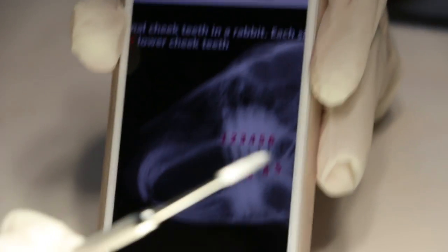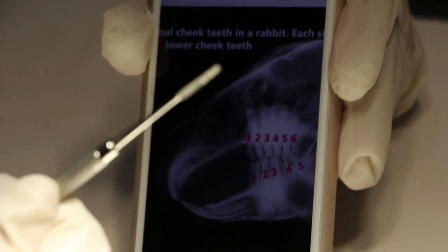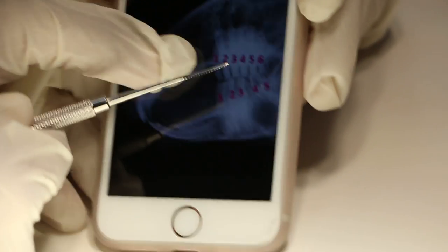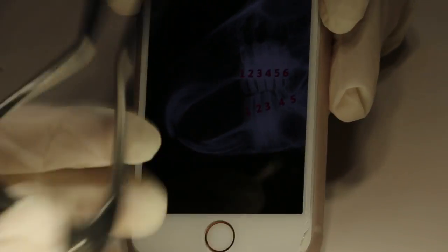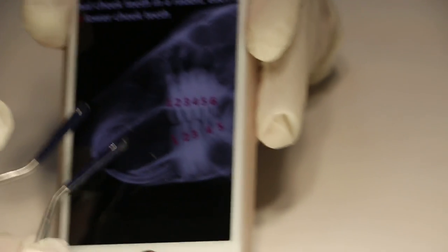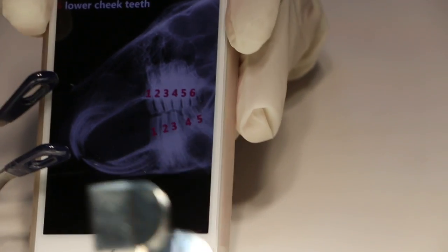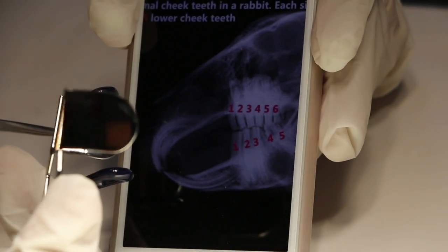Number five: if we don't need to extract but there are sharp molar edges, we use the file to file down the sharp areas. Number six is the mouth gag, which opens the mouth widely. Insert the incisors into the holes and then adjust. When it's open, you use the cheek dilator side by side to open it wider.